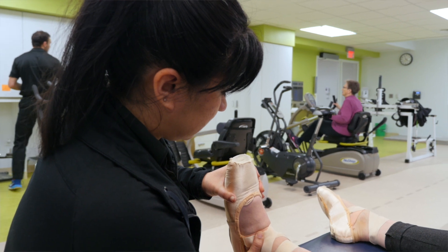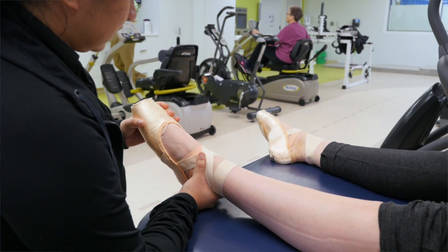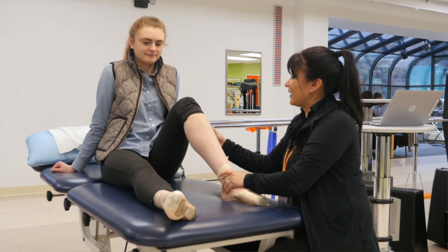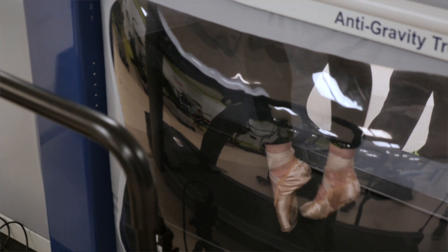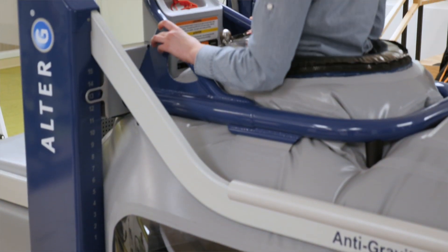The great thing about this is it can be used with all age groups. We use it with folks that are 80 years old, 40 years old. We've had a lot of athletes in their teens and 20s on here as well, and they've all enjoyed it — so we'll be using this with all different age groups.